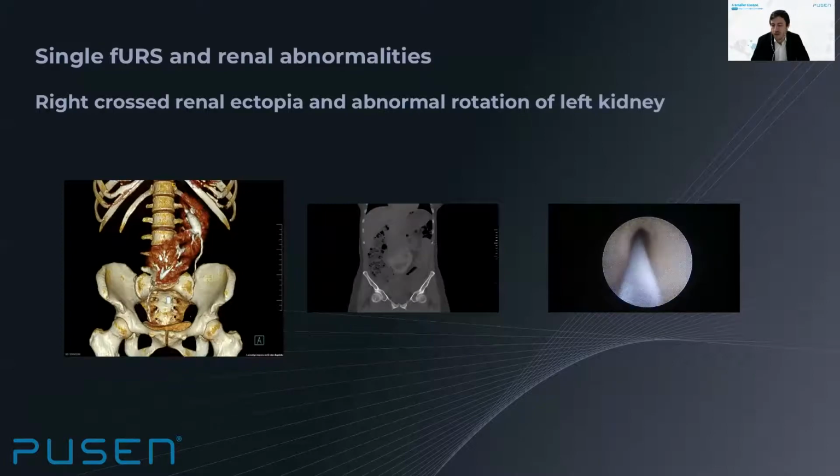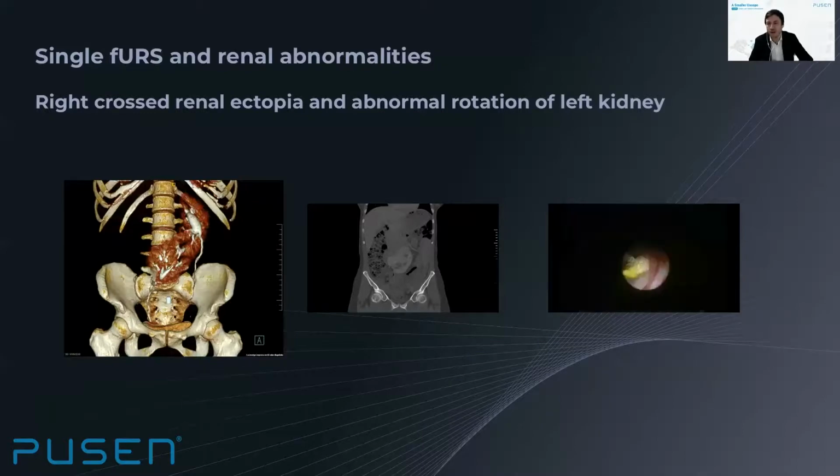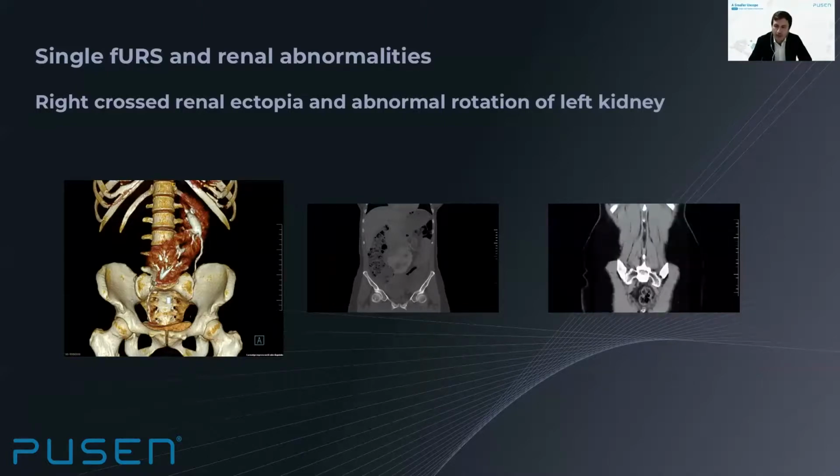So the fiber optic flexible scope was used. Also, all the stone was removed with the flexible scope, and it was quite comfortable because it was in the upper calyx. The complex anatomy of the calyceal system put the scope at risk of damage when checking the residual fragments in the whole collecting system. So a smaller diameter flexible single-use scope would be perfect for this procedure, but with the risk of damaging it.